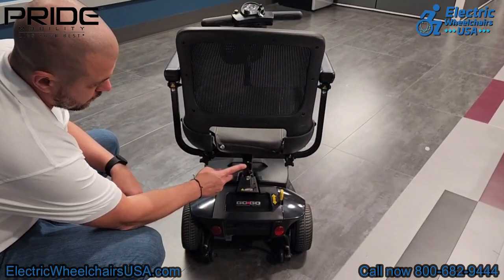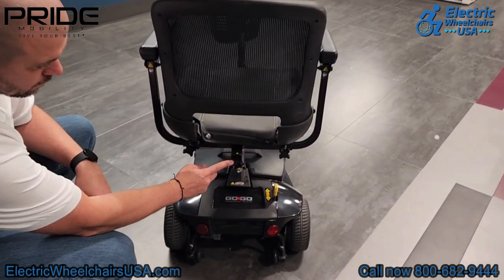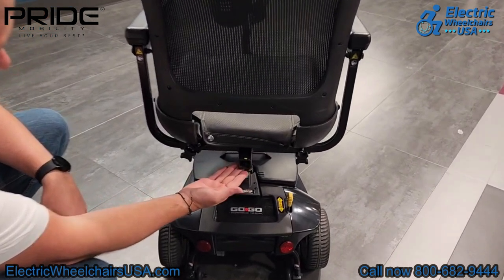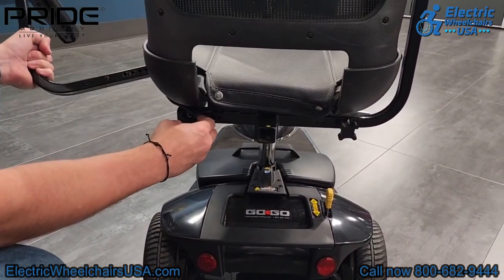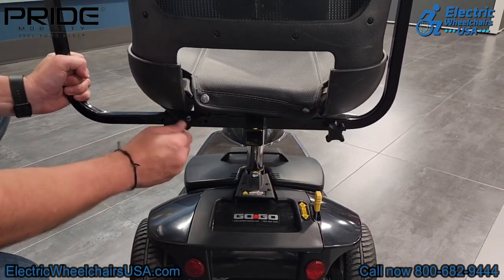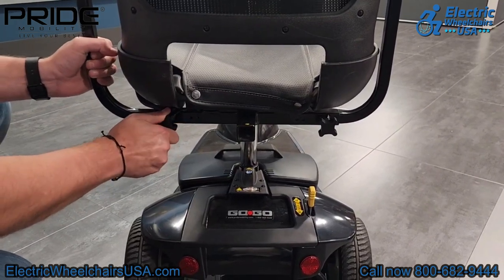With the GOGO Ultra X there is a universal accessory hitch on the back of the seat. We have different accessories you can find on our website to see what you can add to the hitch. Also, the armrests are width adjustable — there are little holes that determine where you can set the armrest position, and you can also remove the armrests if you would like.